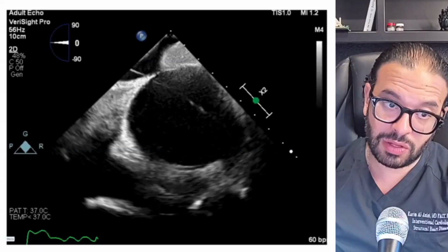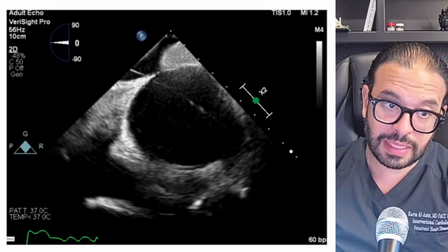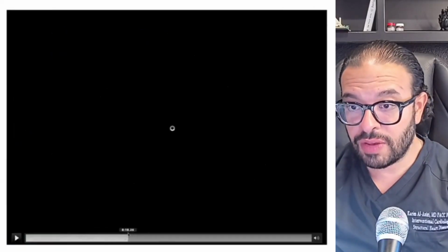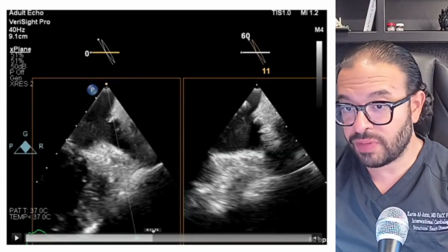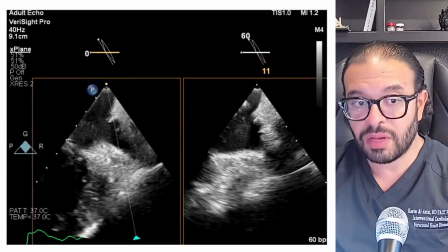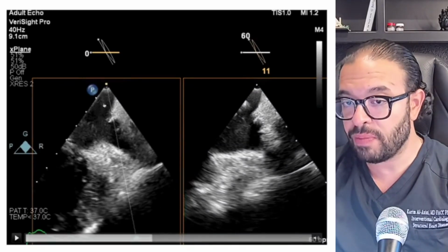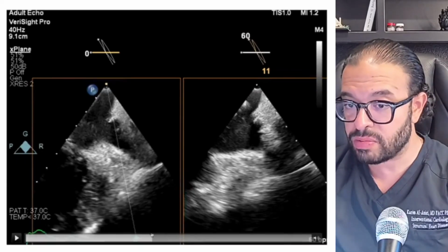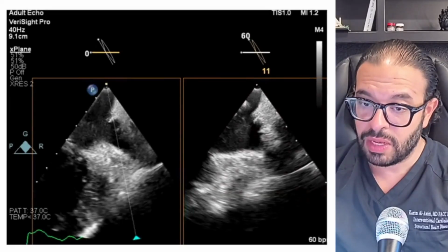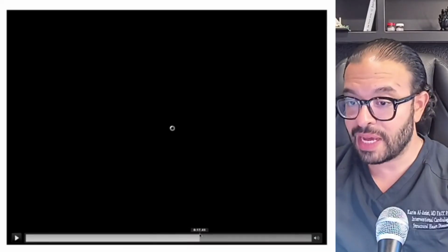So here you're seeing that catheter floss back and forth between the IVC and the SVC. Subsequently, you're going to see that ice catheter move here into the left atrial space in order to give you this direct image of the left atrial appendage, for which then once you put the ice catheter in the left atrium next to the delivery catheter, like you see it fluoroscopically, you're able to visualize that appendage directly. You're able to derive other imaging planes through the X-plane, and you can actually even do some digital steering like you see here with elevation width, where you basically can elevate the image with digital steering without having to move the ice catheter much.